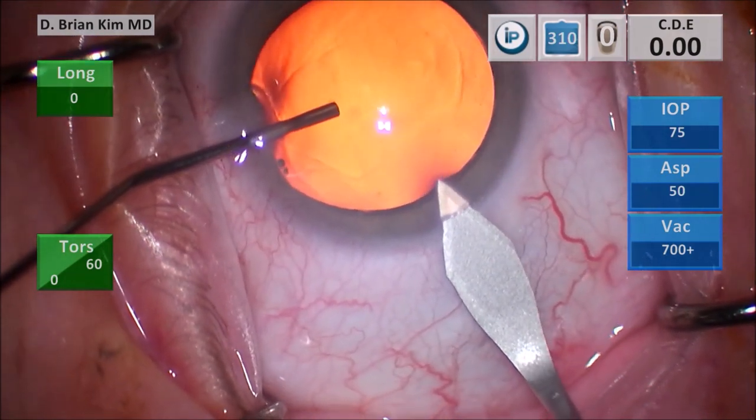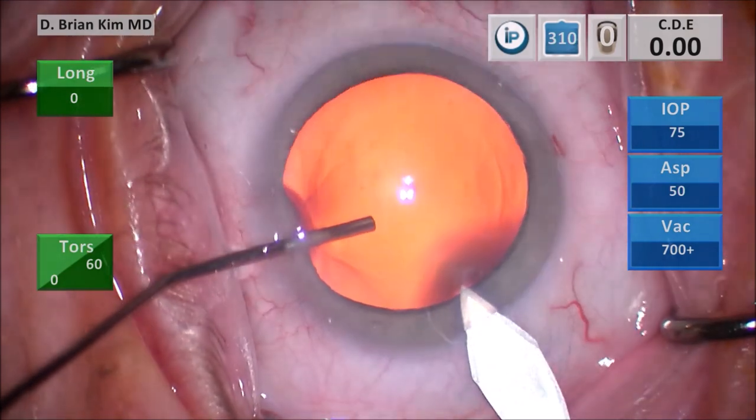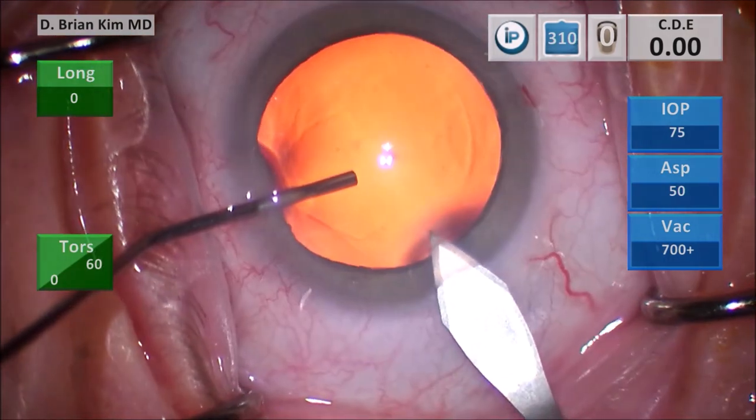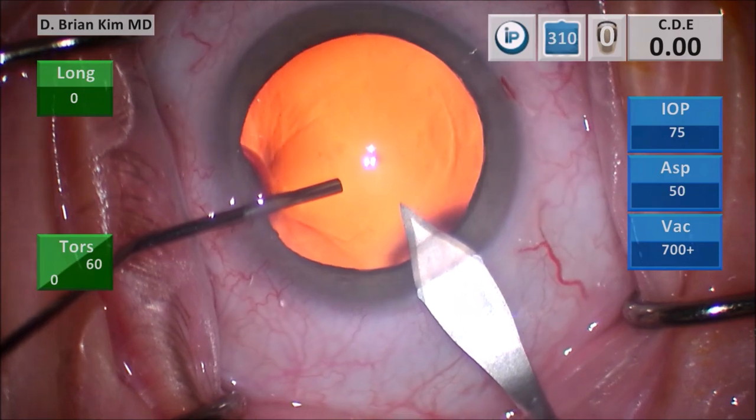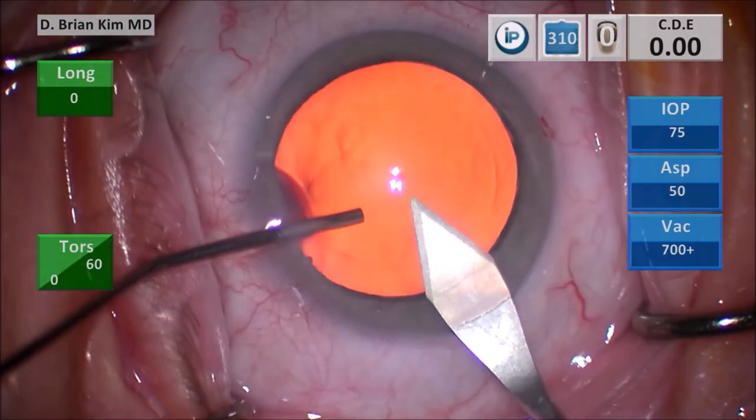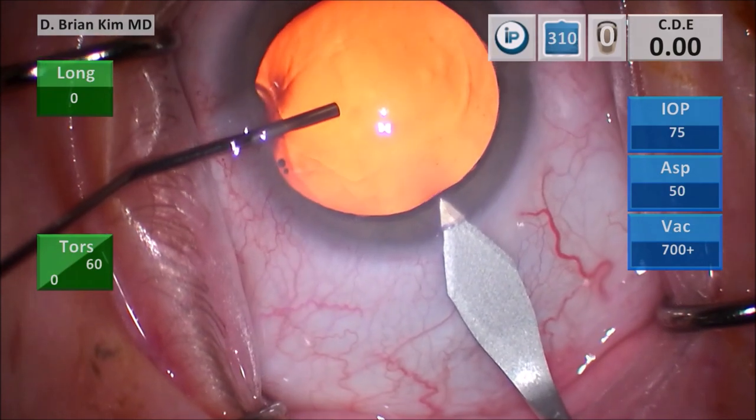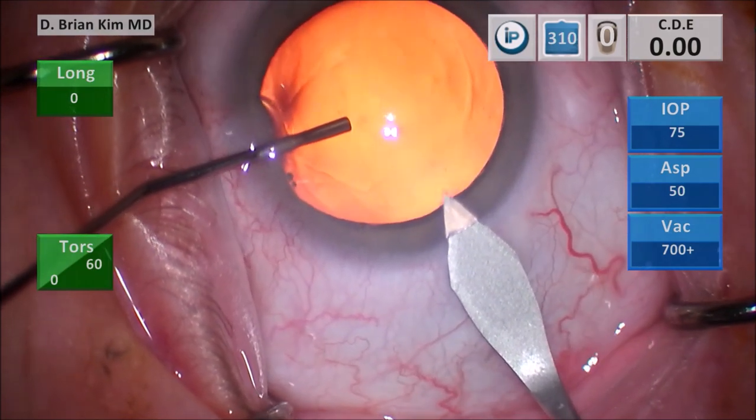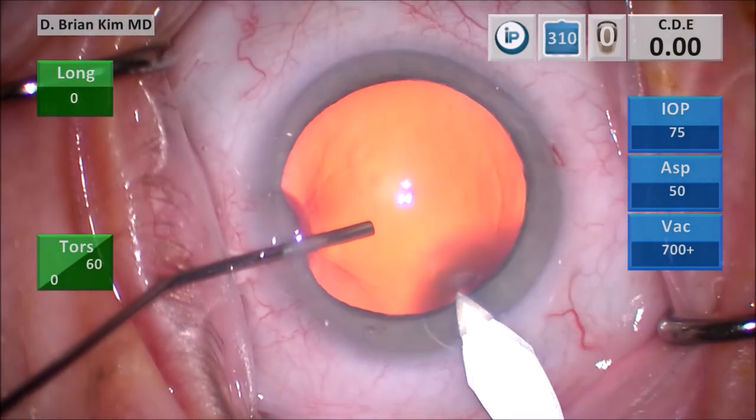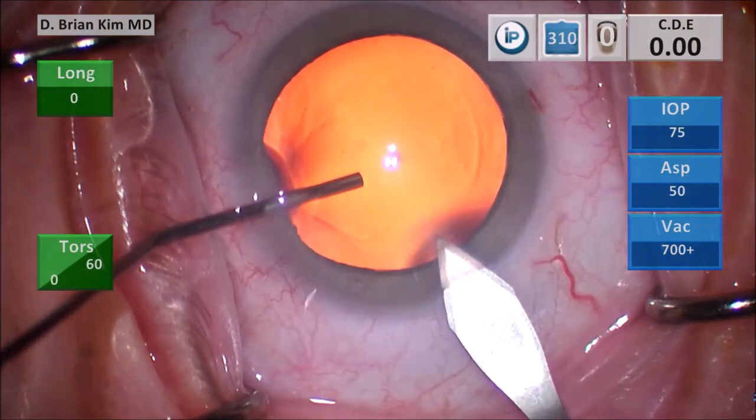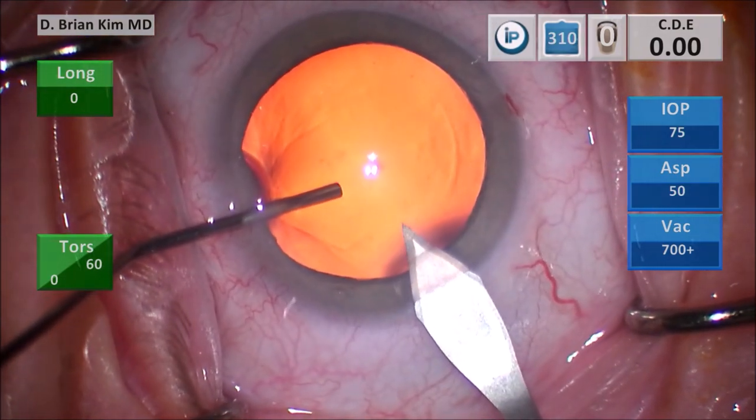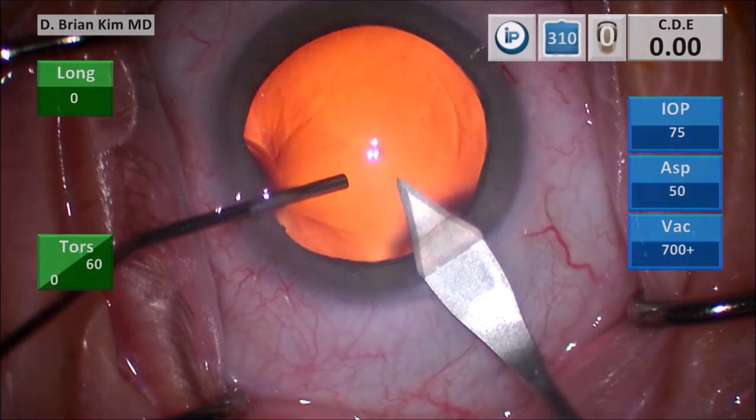You kind of even out, get more parallel, and then you'll tunnel through the stroma, and then heel up and then dive down. So again, once you make your groove, you're going to stab somewhat vertically, push into the stroma, and then rotate your heel down. You're going to tunnel through the stroma, and then heel up and then dive in. You can get a really nice rectangular incision doing it this way.